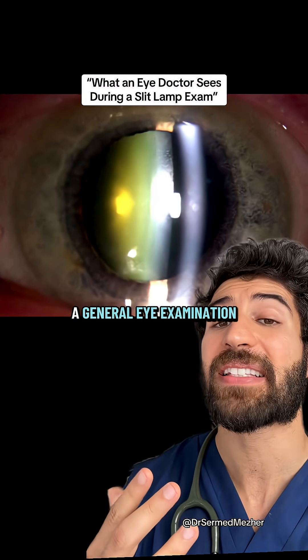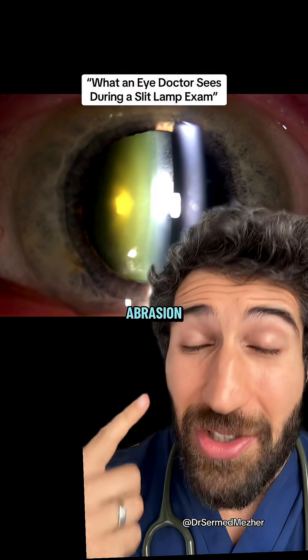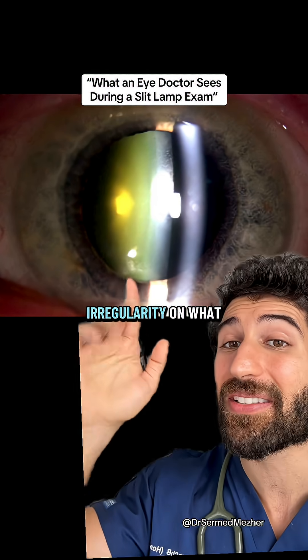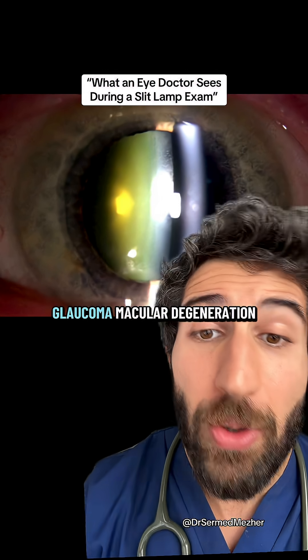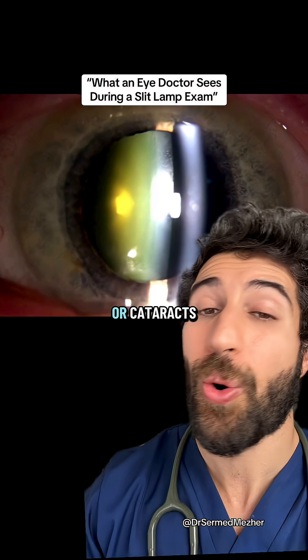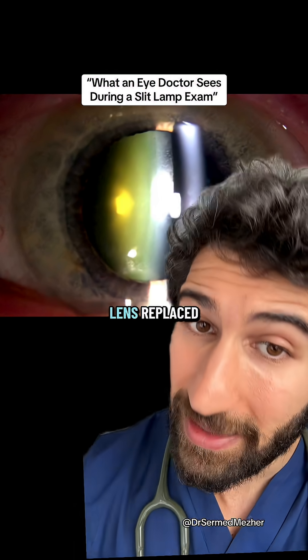It can be used as just a general eye examination or to monitor specific conditions like a corneal abrasion, where you get a bit of irregularity on what should be this smooth outer surface, or things like glaucoma, macular degeneration, or cataracts — of which the patient at the start seems to have had their lens replaced.